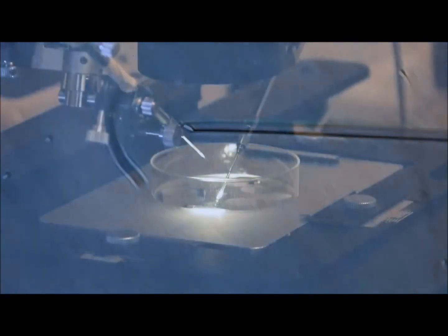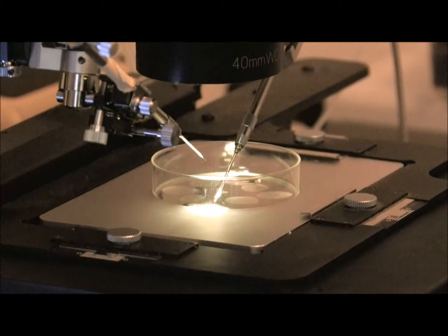The sperm is captured with an aspiration pipette by immobilizing the sperm with trauma to its tail, and then one sperm is aspirated tail first into the injection pipette.